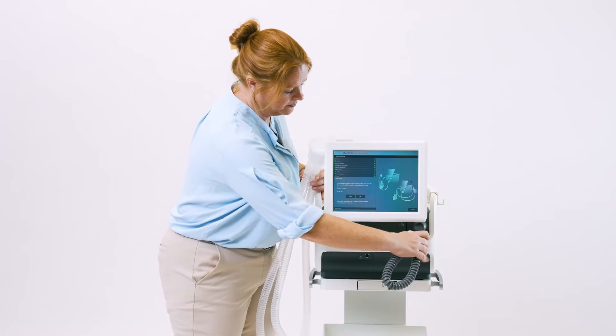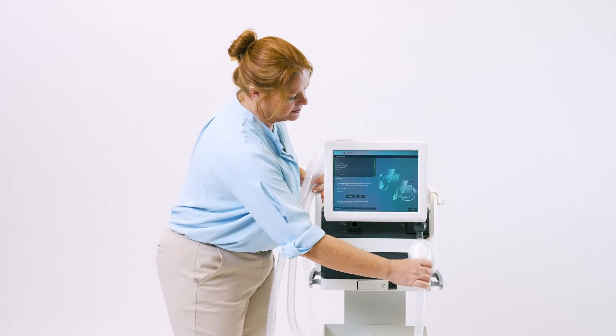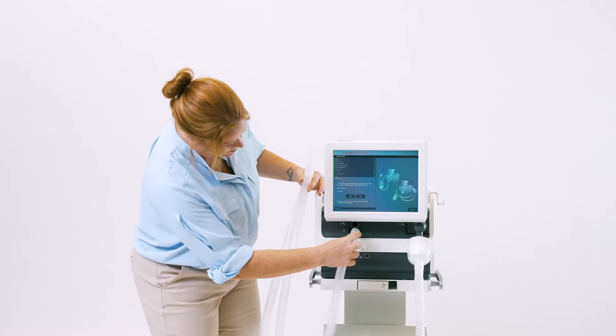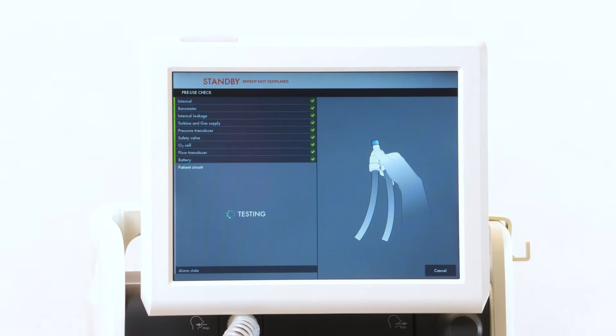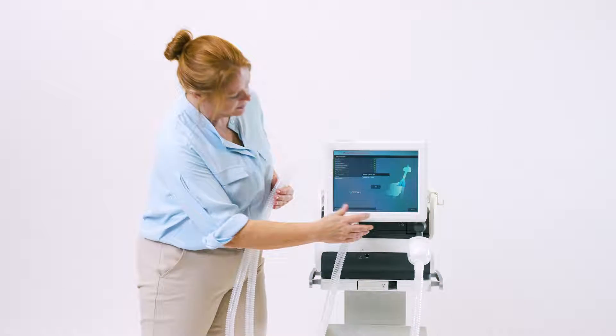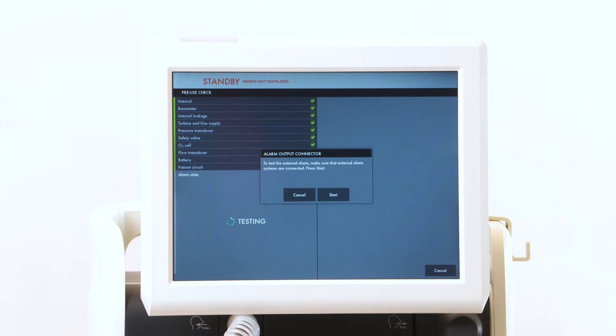Disconnect your test tube and connect your circuit. Then hit OK in order to start the calibration. Unblock the tube and press OK. Your pre-use check is then complete.